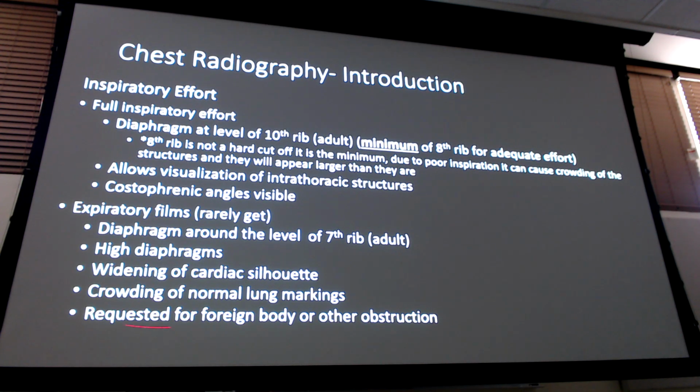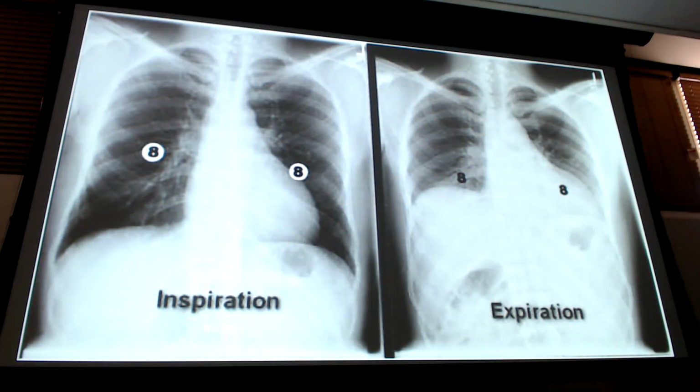Expiratory films, here's the info on that. If I give you an expiratory film, I'm going to tell you it's expiratory because they're so rare. So you're not going to have to determine the adequacy of an expiratory film in this course, because it's super rare. There's only 1 or 2 cases when you would possibly get it. So it's just more for your information there. I'm not going to make you pull that out. But inspiratory, you have to be able to know there are enough ribs in order to say that it's adequate.